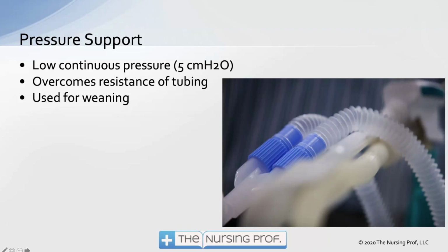And the same thing is true with our ventilator tubing. Our ventilator tubing is going to provide resistance to that patient's being able to breathe. So we put the patient on pressure support. Pressure support is just a low amount, maybe 5 centimeters of water, continuous pressure that helps to overcome the resistance of the tubing. We'll also use it in many cases when a patient is weaning. We'll put them on pressure support and just turn off the ventilator. Now they're breathing spontaneously on their own, but we're using the pressure support to simulate what it'll be like when they're off the ventilator and they don't have to breathe through all that tubing.